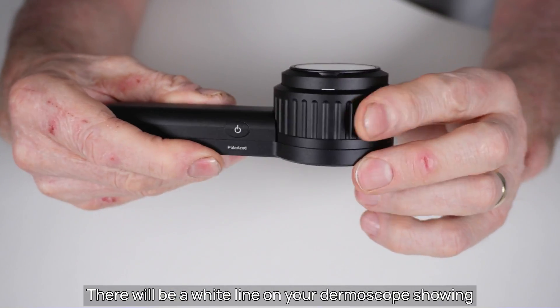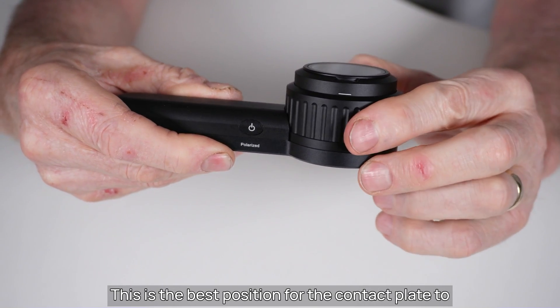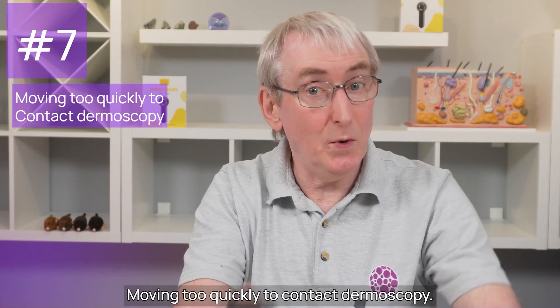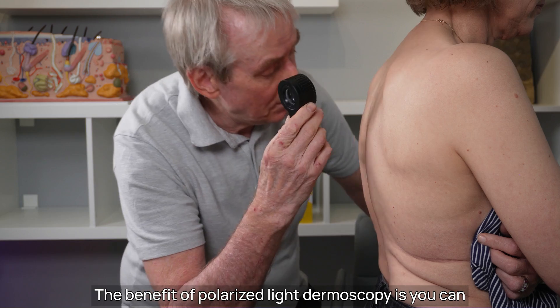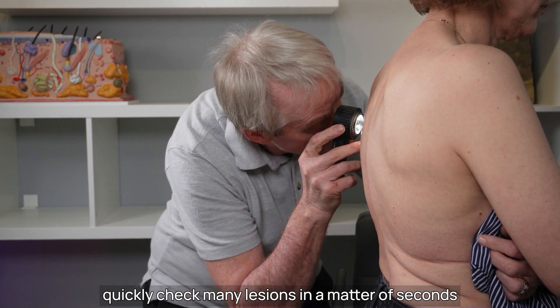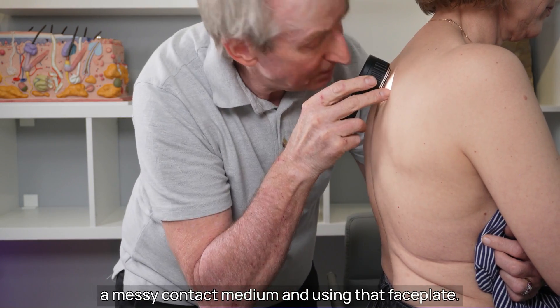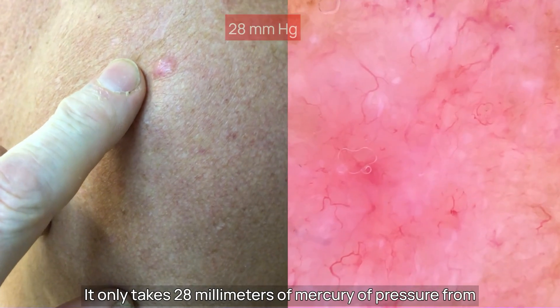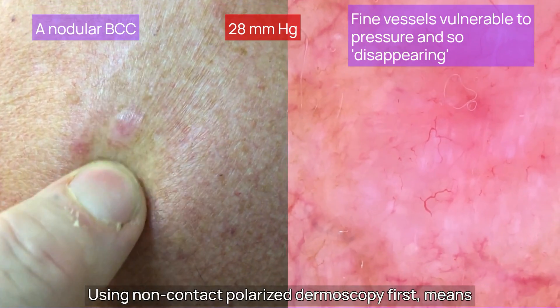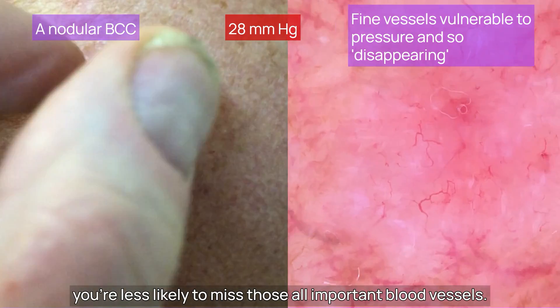There will be a white line on your dermoscope showing the neutral position when you extend the face plate. This is the best position for the contact plate to take a photograph using contact dermoscopy. Mistake number seven: moving too quickly to contact dermoscopy. The benefit of polarised light dermoscopy is you can quickly check many lesions in a matter of seconds across the patient's skin without the need for applying a messy contact medium. It only takes 28 millimetres of mercury of pressure from a contact plate to occlude blood vessels within the skin. Using non-contact polarised dermoscopy first means you are less likely to miss those all-important blood vessels.